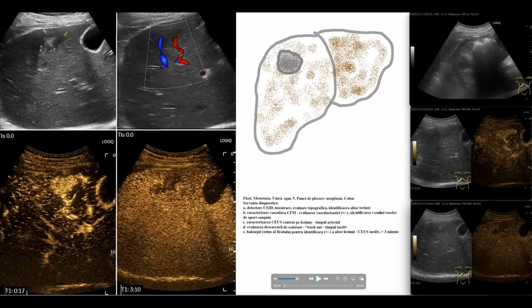This is the inflow vessel. This is an outflow vessel. This is a hepatic vein. The inflow vessel is important because it's going to be smeared on the contrast examination. It should also be noted that the tumor formation does not show, at least in Doppler terms, the circulatory signal.